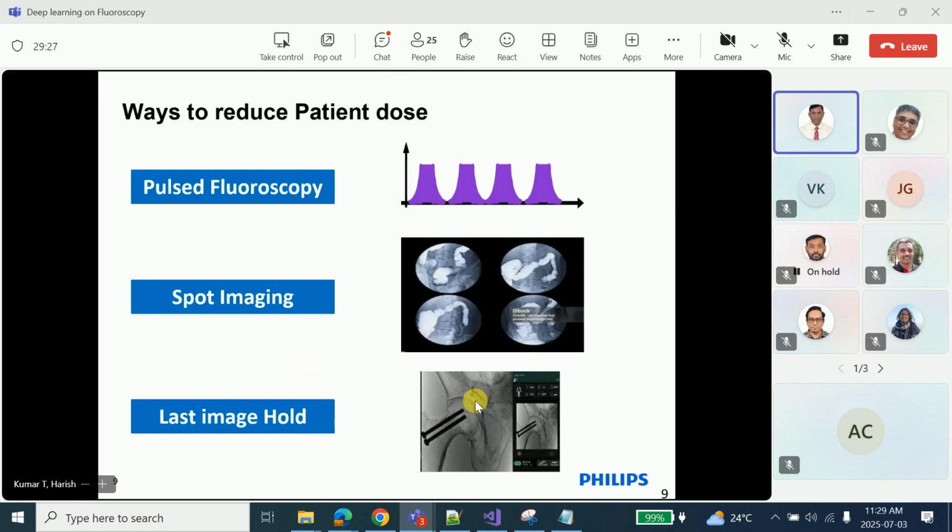Fluoro, we will be using for pathology detection live. For example, if you see all organs including one system, if I want to see the esophagus, my digestive system pathology, I will be including from mouth to the complete organ, where I have to see if there are any obstructions, any lesions.